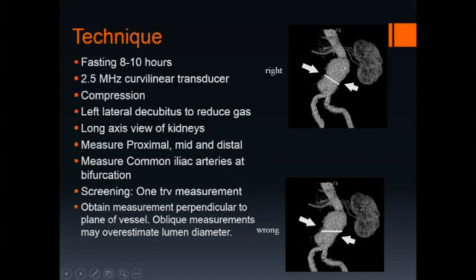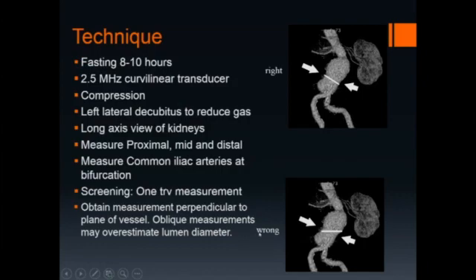It is important to obtain measurements perpendicular to the plane of the vessel. The aorta can be a very tortuous structure, and in this case the correct way to measure the diameter would be to place the transducer in a slightly oblique orientation, because that is perpendicular to the course of the aorta. If the transducer is placed in a true transverse plane, an erroneous measurement will be obtained, resulting in overestimation of the luminal diameter.